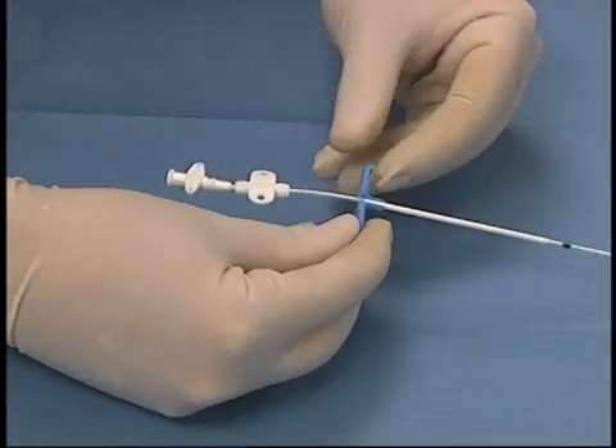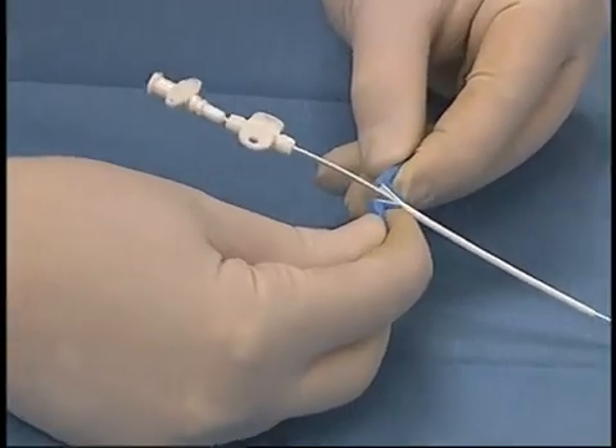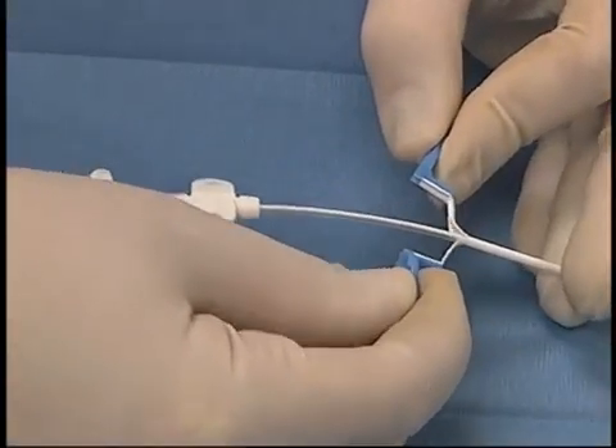The catheter is inserted up to the desired length, and then the wings of the peel-away sheath are snapped apart gently and gently removed as the catheter is fully inserted into the vessel.